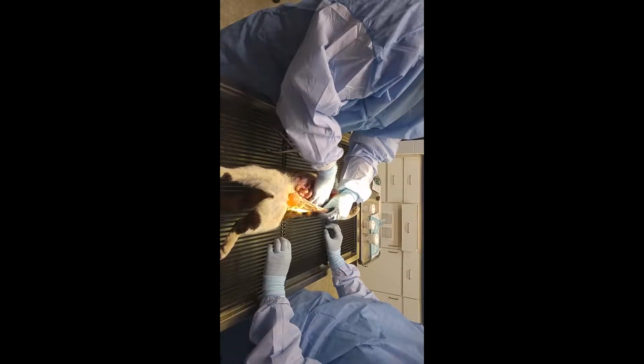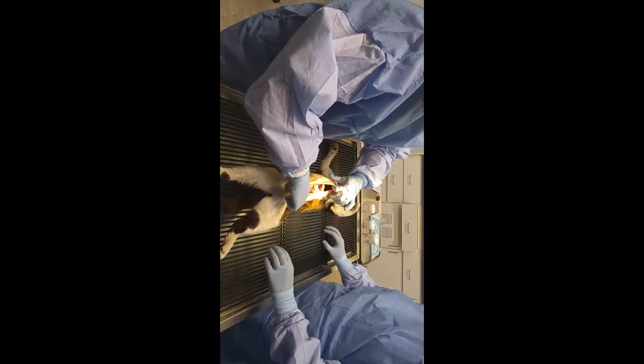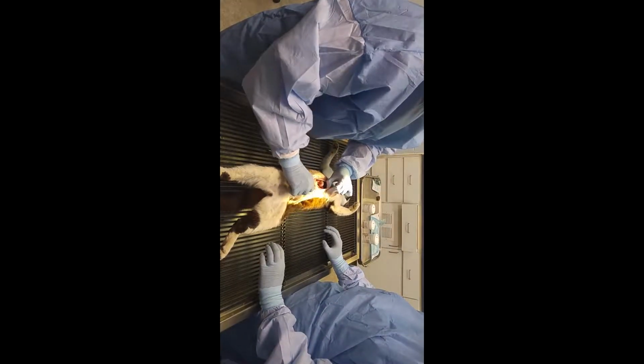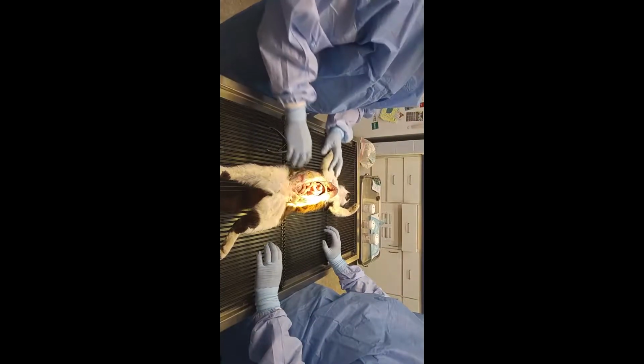Okay. So now we're just going to replace the abdominal contents, and we are going to close the defect before sending the kitty to be cremated.